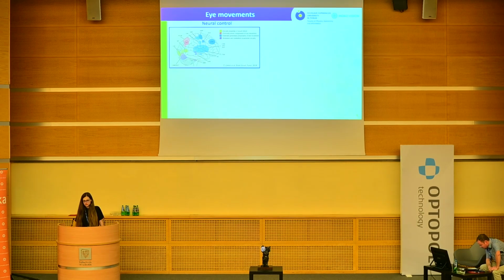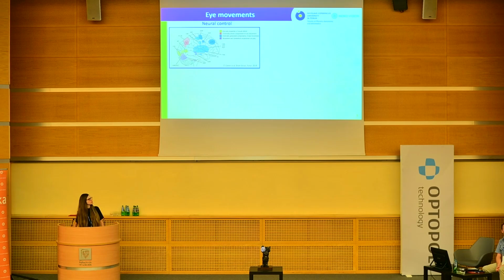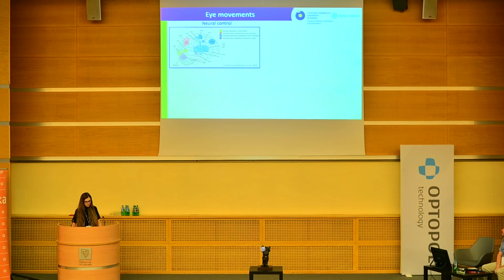We can, of course, use EEG, but these measurements can be time-consuming and also not very comfortable for the patient. So maybe we can change our thinking and not focus on measuring the brain activity directly, but focus on measuring the neural response.